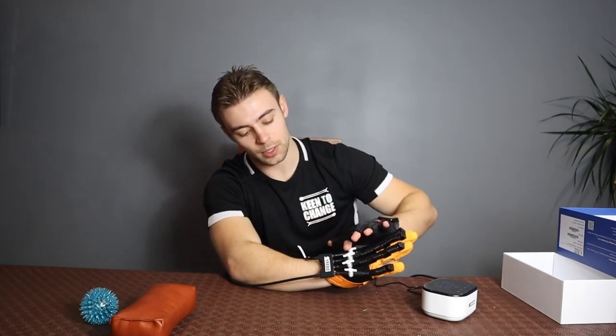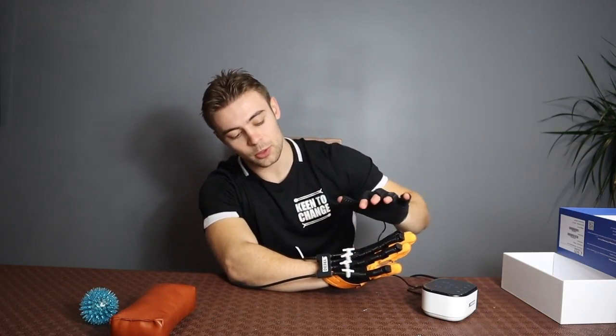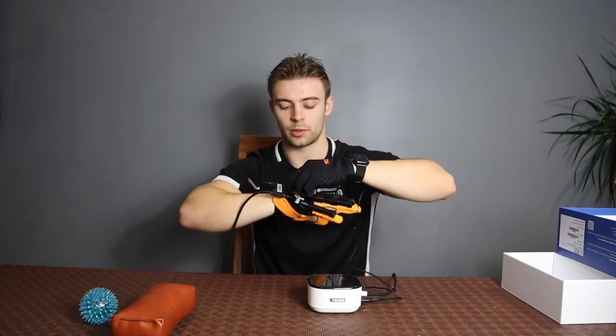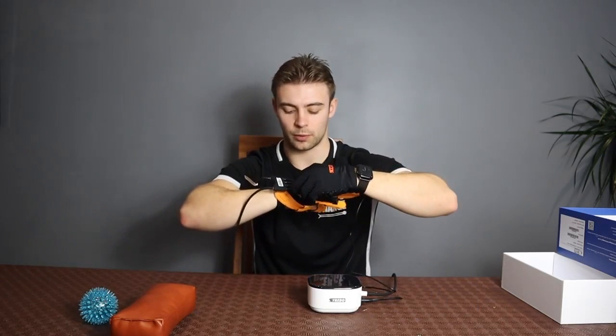This glove is specifically very clever because it has these valves here, which means you can train individual fingers of each hand. So what we can do is close off each one of these valves and actually train individual fingers.